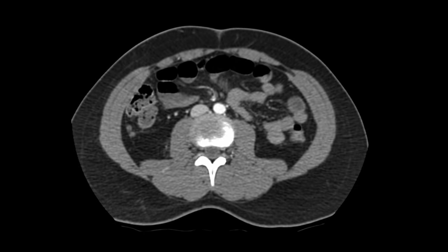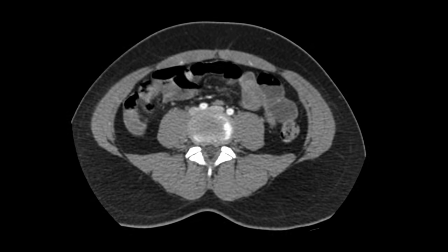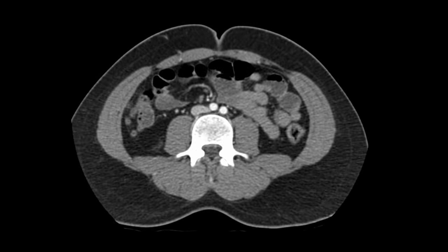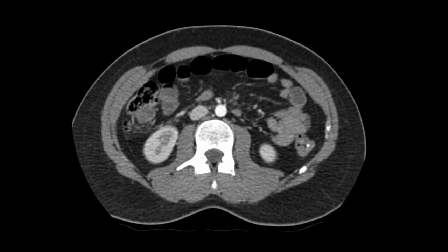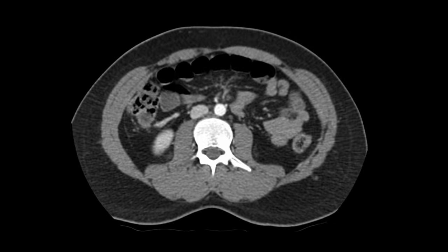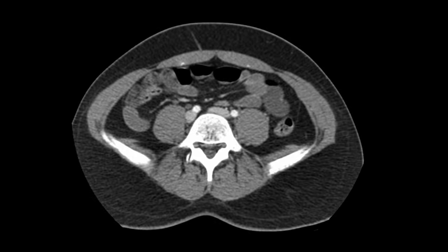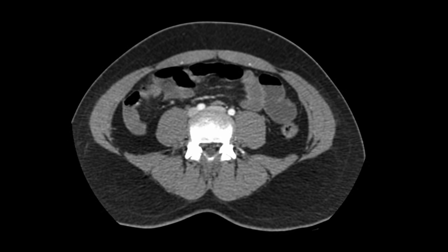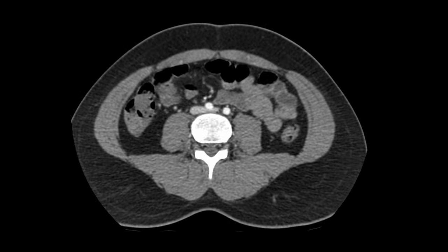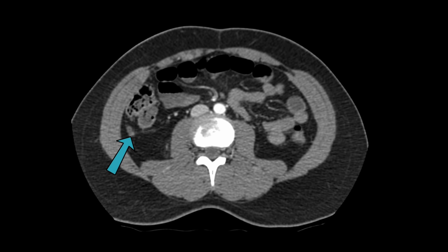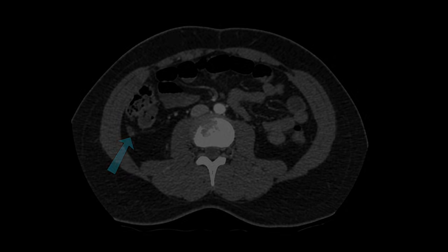Identifying the appendix on a CT scan can be a real difficulty. See if you can identify the appendix on this scan. You should be looking for a blind-ending tubular structure arising from the cecum. Now that we've seen what an appendix looks like on CT, let's have a look with ultrasound.